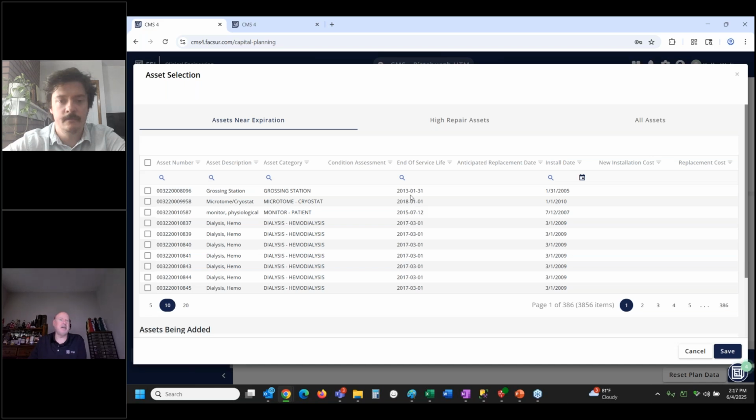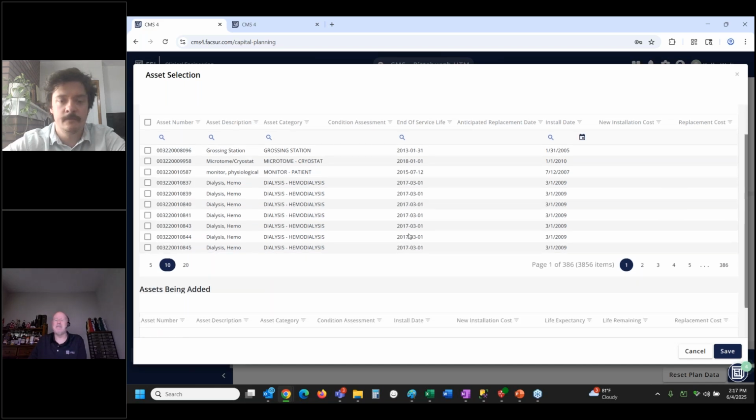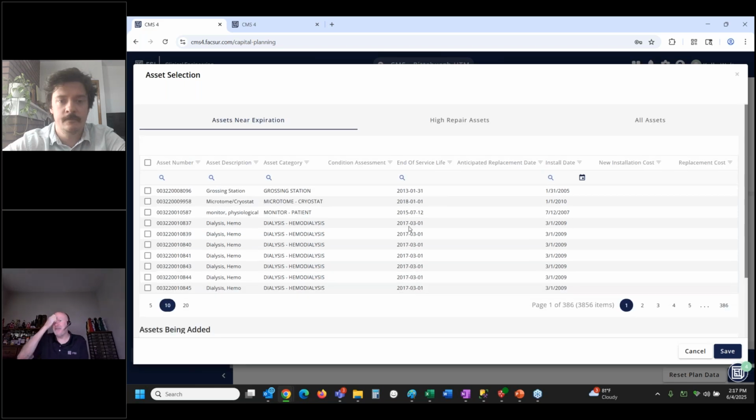It doesn't just show me everything in 2026 because there are some things, like you said, that go past their useful life. We've been maintaining them very well. It's like an old car. You could have a 1960 car that runs great, or a 1960 car that is sitting in your garage and won't start at all. So it depends on how much you take care of it and how much you do those types of things.